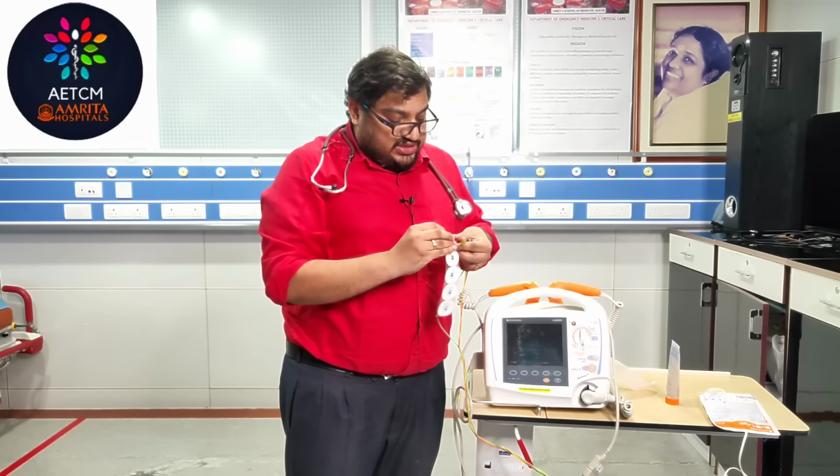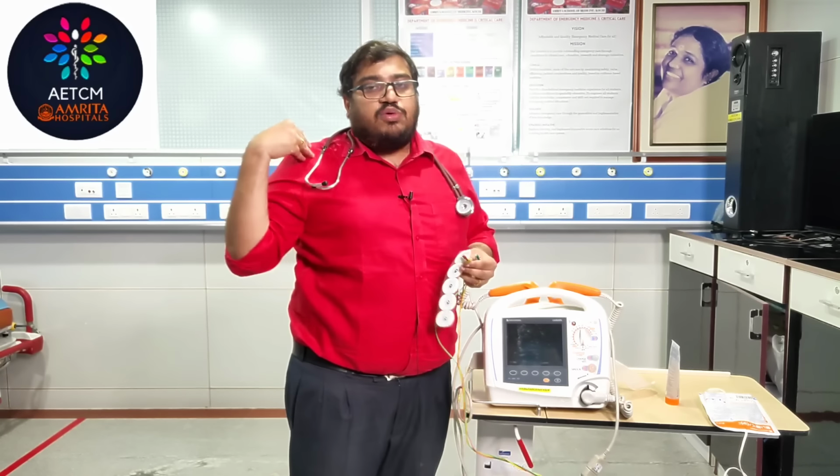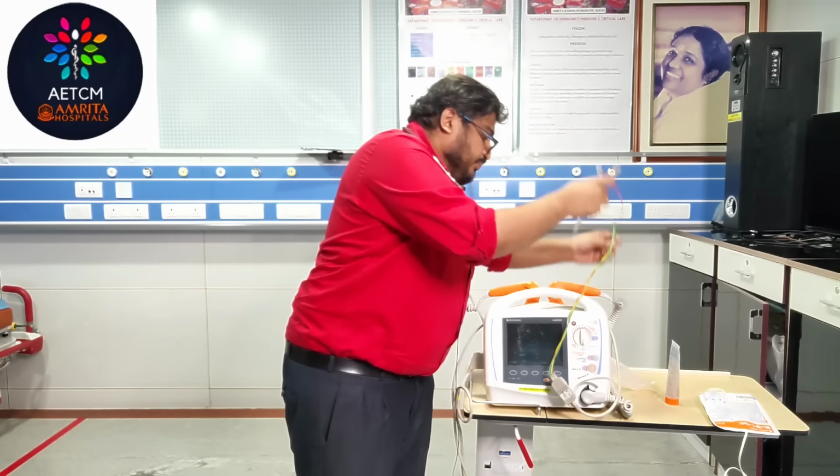So you need to fix this on, and you need to fix it over the patient's bare chest. So red over your right shoulder, yellow over your left shoulder, and green over your apex. So these are the 3 things that you need to connect.